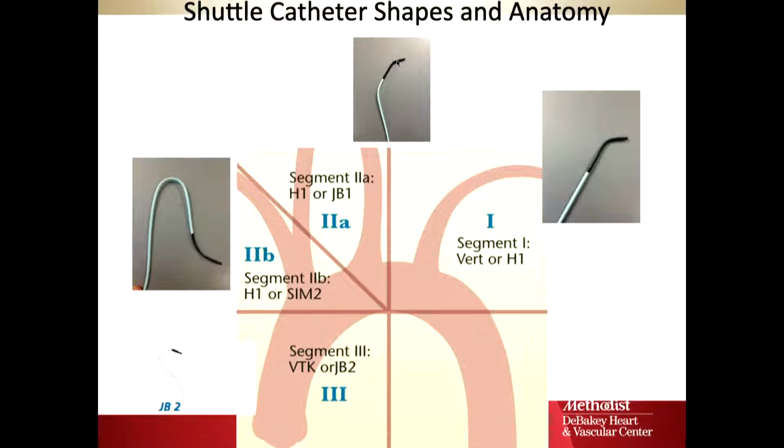It's got one curve, two curves, and it's designed so that this sits in this area here, and it drives the apex of this catheter, the tip of this catheter, along the outer wall. And when people say they navigate catheters up and over the aortic arch, they don't navigate a damn thing. What they do is a series of wall contacts. You use the outer wall of the aorta.